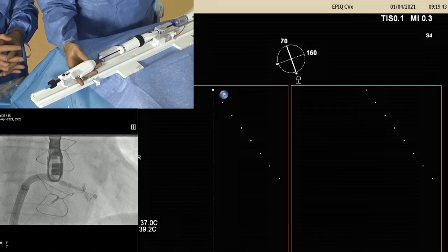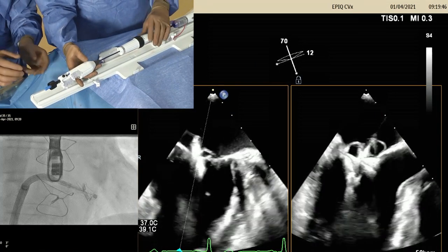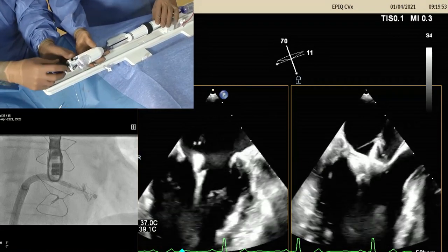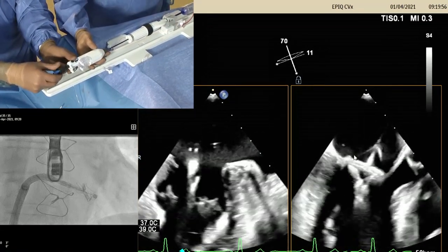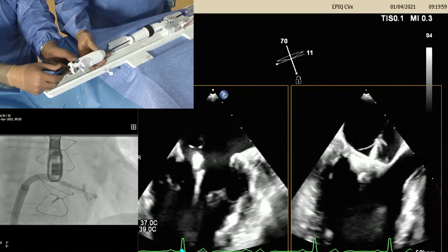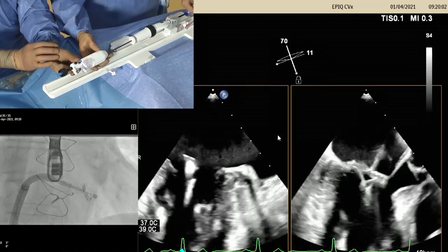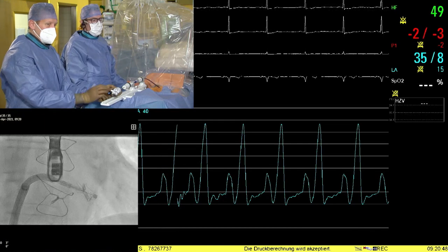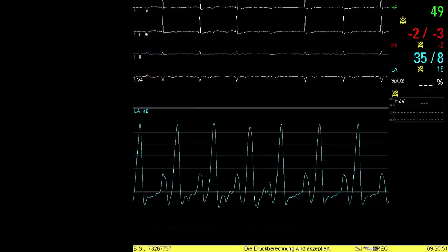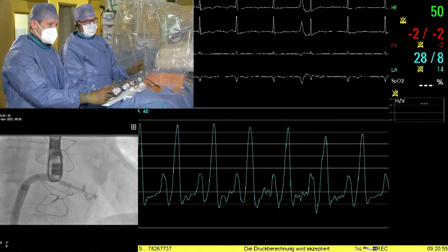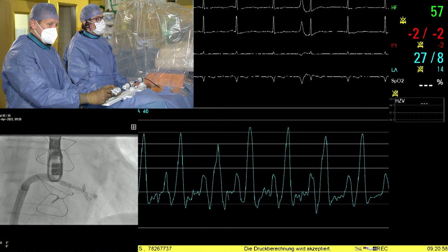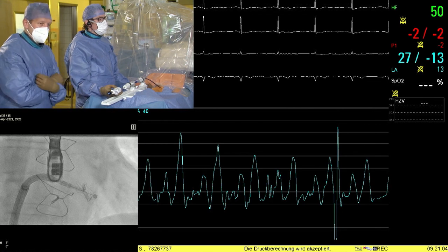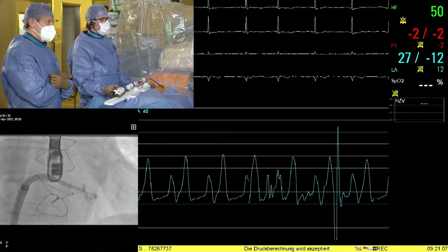The posterior clasp is brought down — also bouncing up and down, indicating a good chunk of leaflet tissue. Simultaneous pressure tracings are placed on screen. The device is closed with the expectation of seeing tension building on the leaflets and a decrease in left atrial pressure, especially the V-wave. This is exactly what was observed. Breathing is resumed.